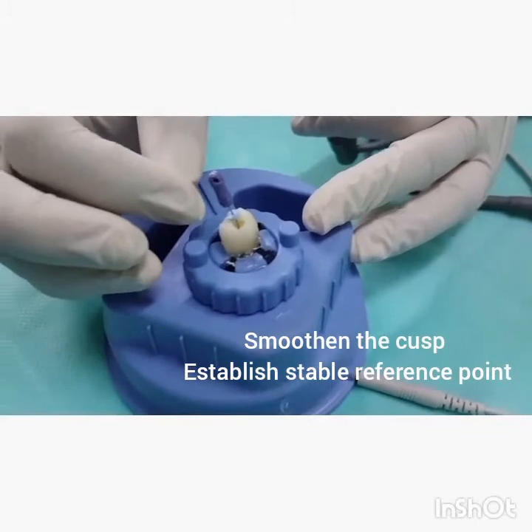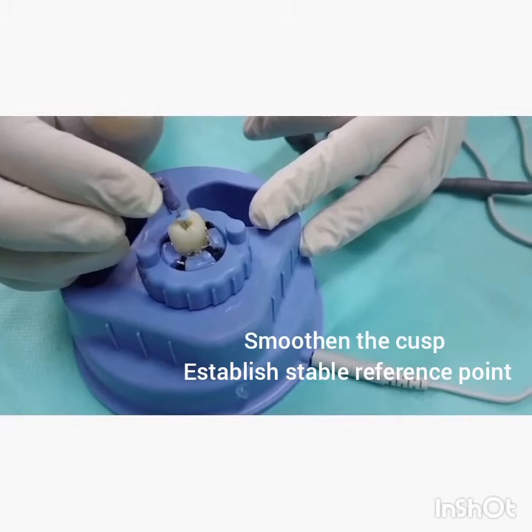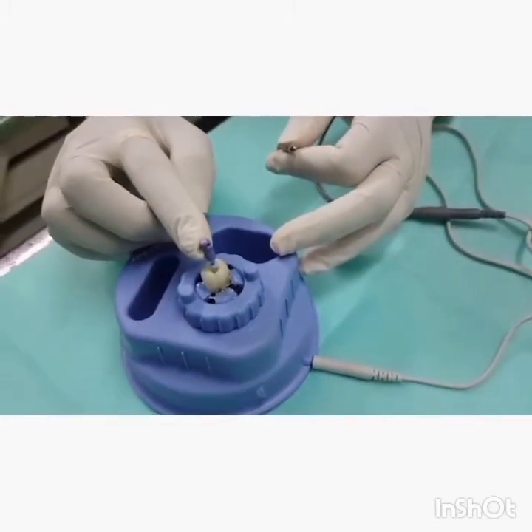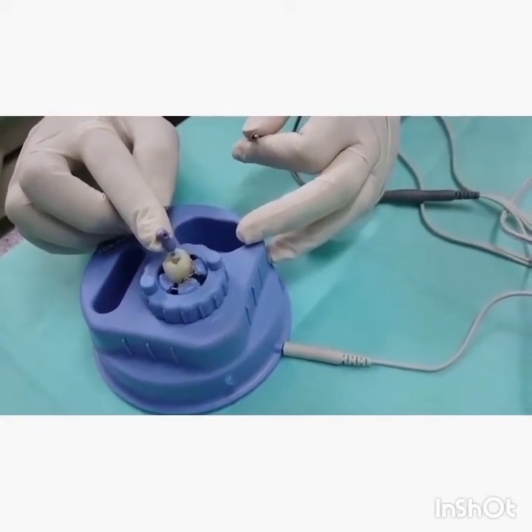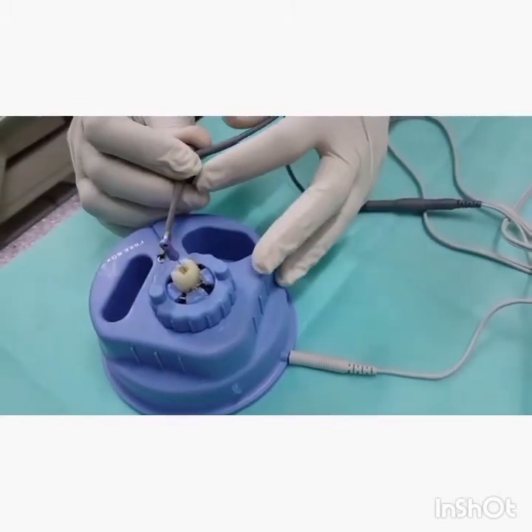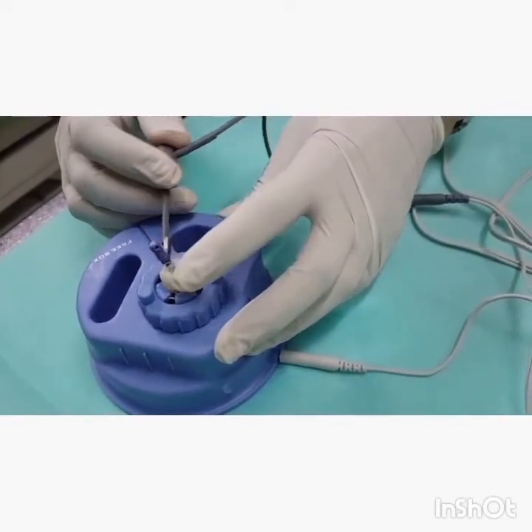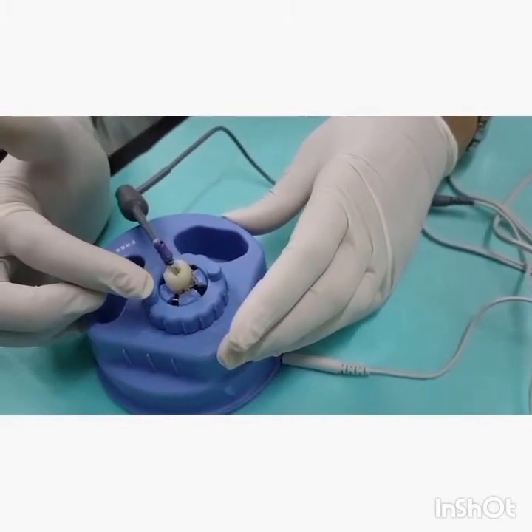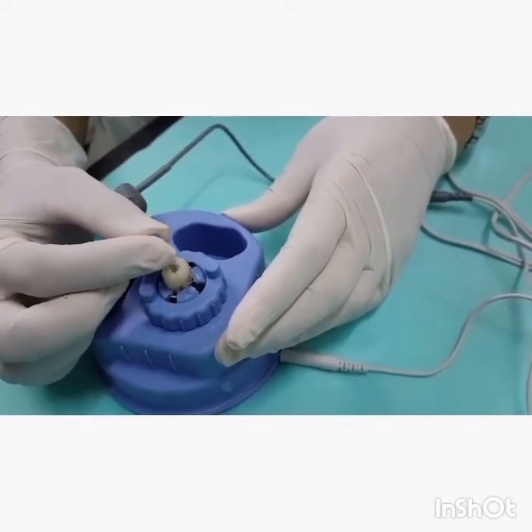While placing the file, ensure that you have a repeatable stop for accurate measurements. Ensure that the metal file does not touch a metal restoration or a crown during the process of working length determination. Attach the file holder to the metal file.